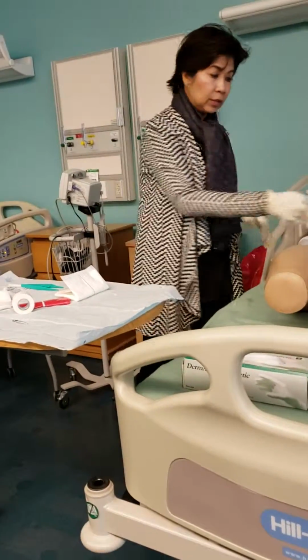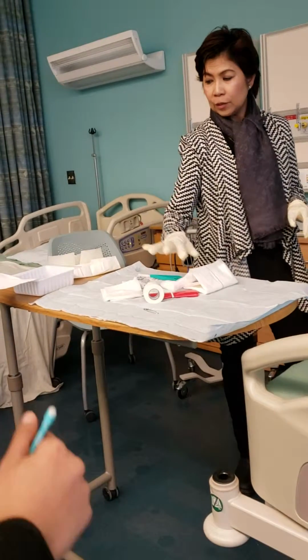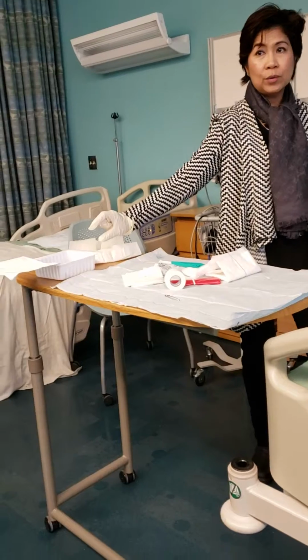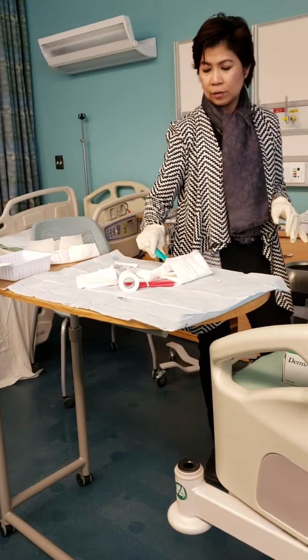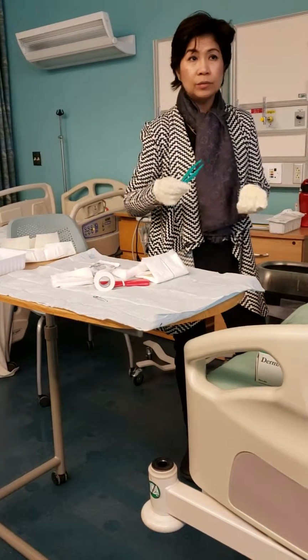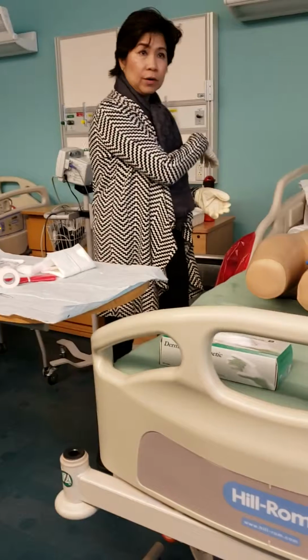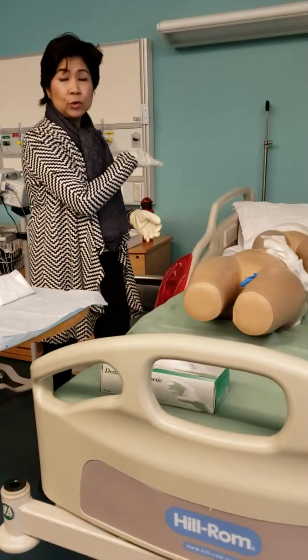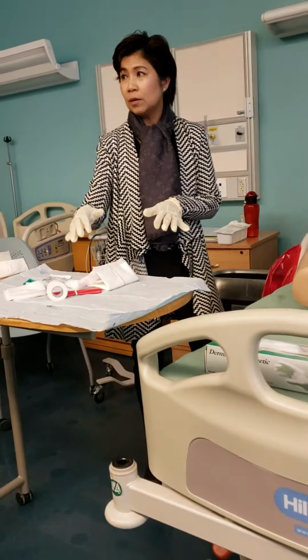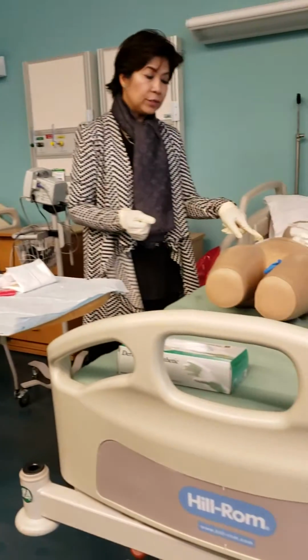If you don't have the swabs, you clean it, but then you have to discard it. But you have a lot of gauze here, already soaking, and you're just wringing it out, as long as you're discarding. You're still sterile because anything that you touch here is still sterile, and then you're just wringing out the water. So now this is wet.